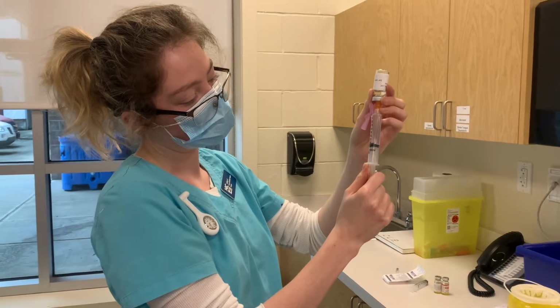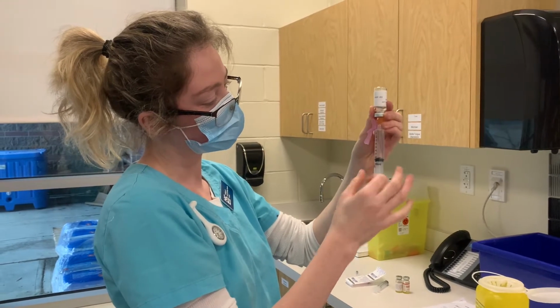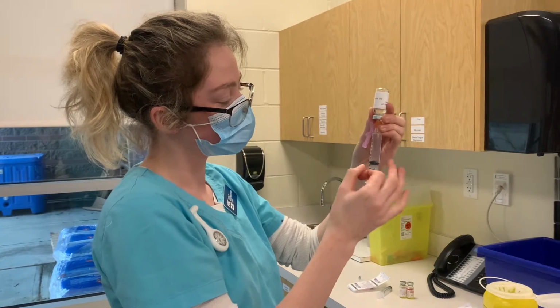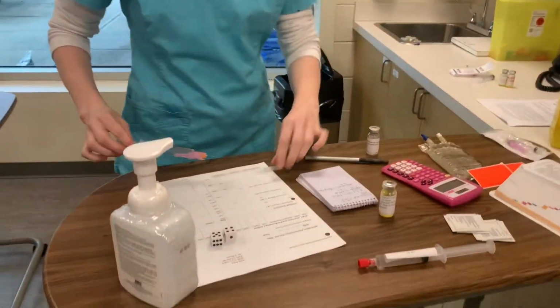Now I'm going to bring it a little bit past 8 ml so I can tap the air bubbles out. Now I'm going to scoop.